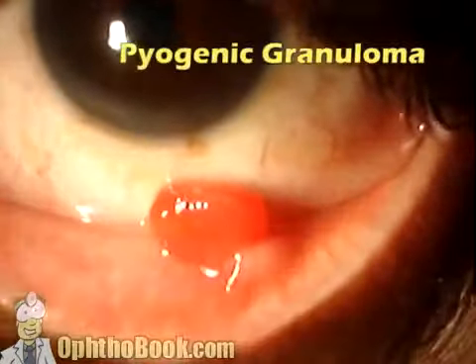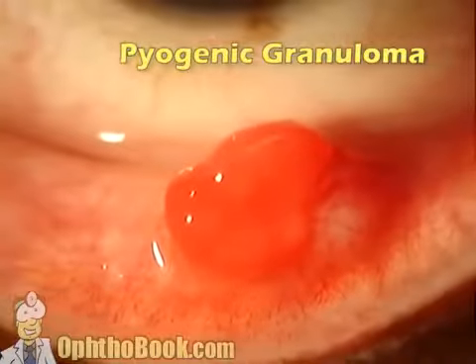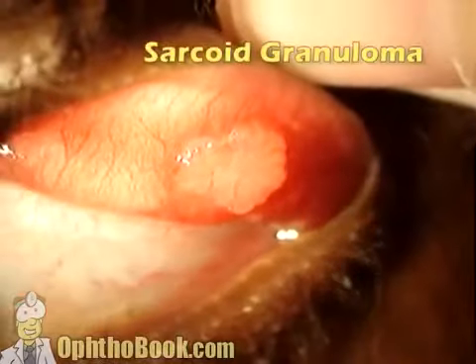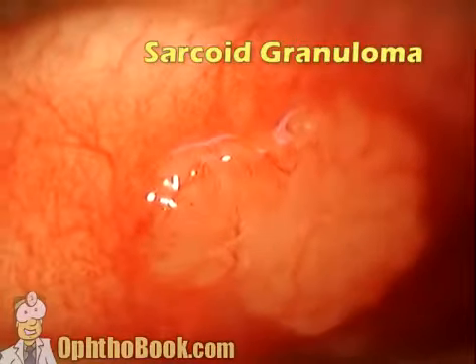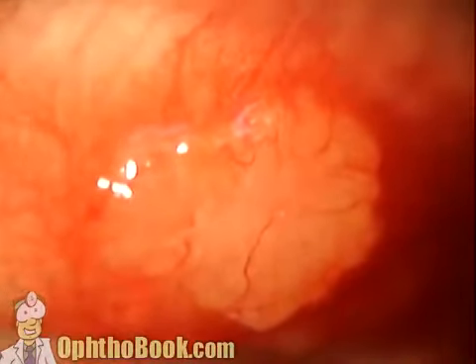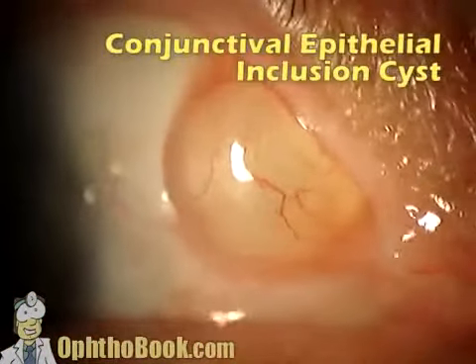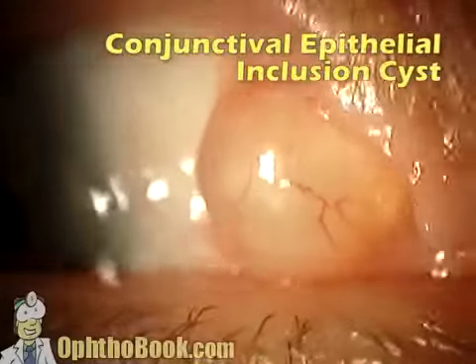Why do I flip the eyelid? Because sometimes you have things like pyogenic granulomas, which is associated with chalazions. We'll look at the upper lid. Here's another lesion. This is some type of granuloma. We biopsied it, ended up being sarcoidosis, and we diagnosed that disease process. Looking at the conjunctiva and sclera, the conjunctiva here has a very large cystic structure.